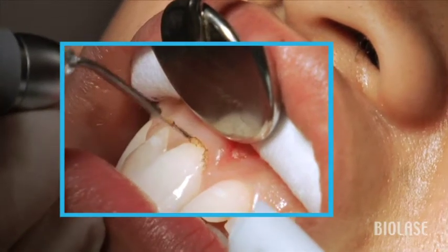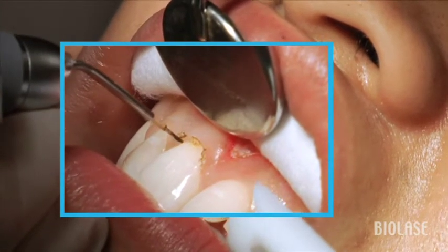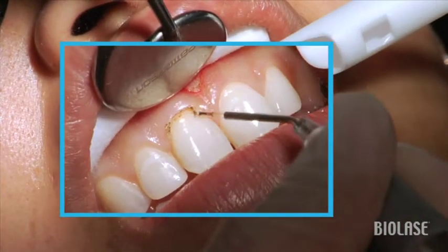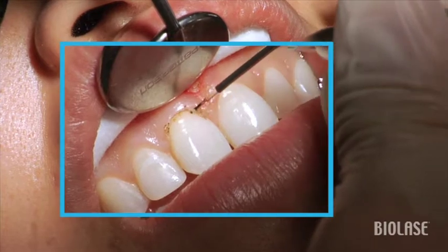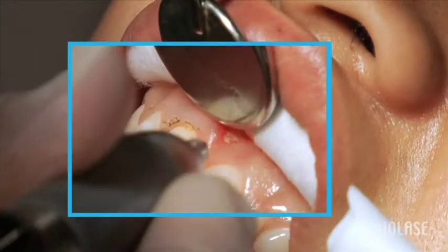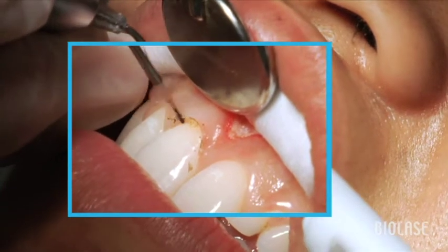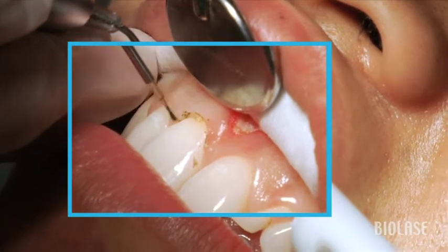We've placed a topical anesthetic previously, and because we're only removing about a millimeter of tissue, it's really not crucial at what angle we hold the laser in order to adjust this tissue. Note that this video is shot in real time, and you can get a sense for how quickly this tissue can be recontoured very nicely. Notice how much more efficiently the laser works when you're able to initiate the sides and not just the tip.